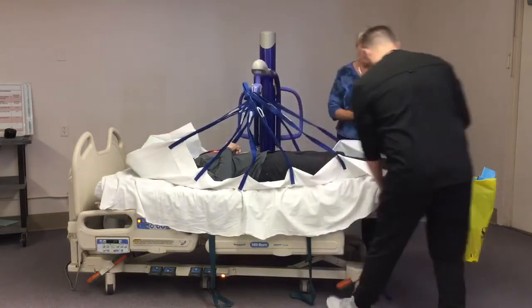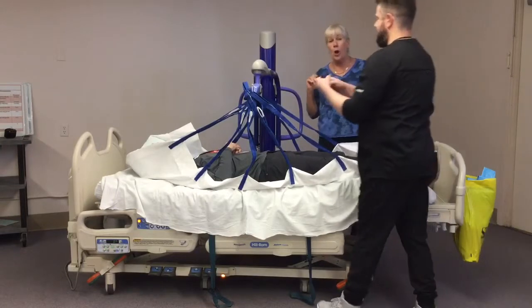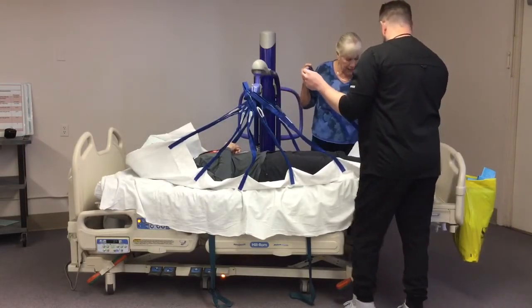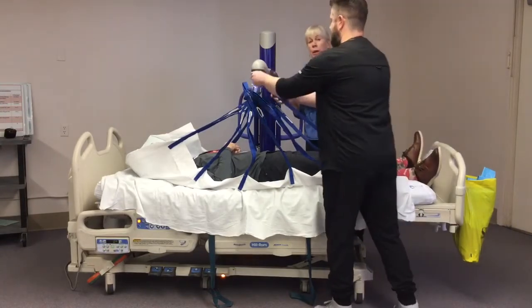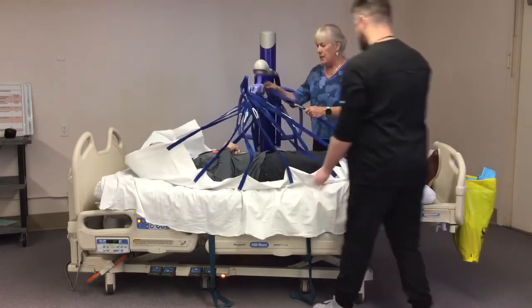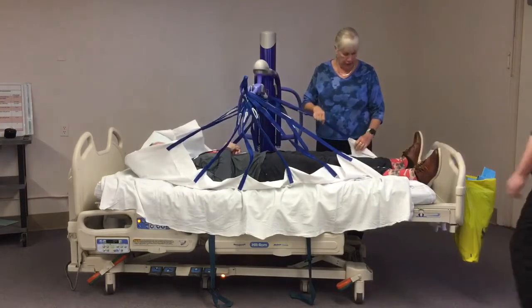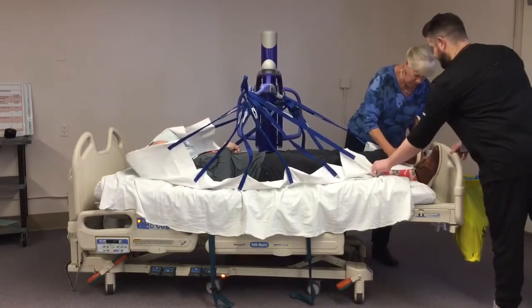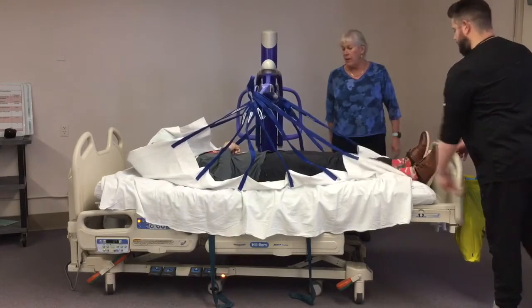down at the feet. Now, if your patient is really tall and you can't really get these attached, you can get the feet out of the sling. You can put a pillow underneath it if it looks like it might be a little bit too harsh on their ankles. But my patient's a little bit tall for this machine. We might just almost make it, okay?